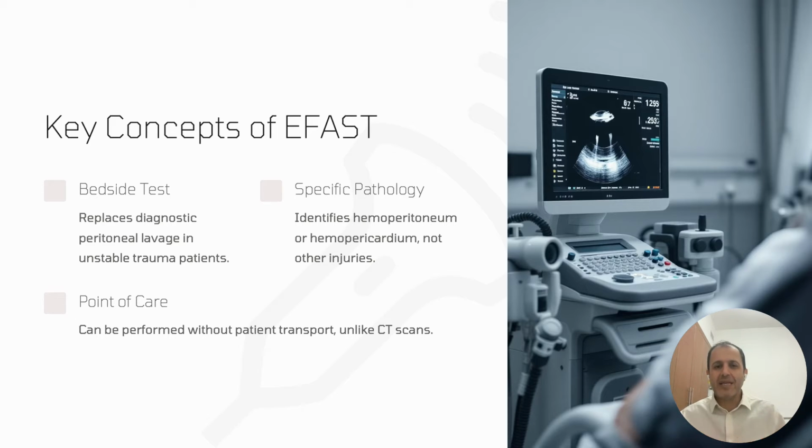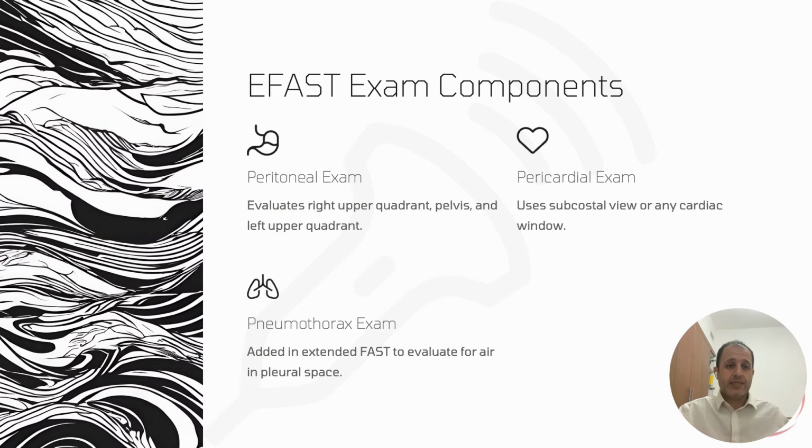Sometimes it's not safe to transfer a patient because of potential complications. The patient sometimes is not stable enough to transfer. So in these cases we can save the patient, and you can save time. That's why it's very important for emergency medicine physicians to be familiar with using ultrasound like EFAST in trauma cases or in unstable cases.